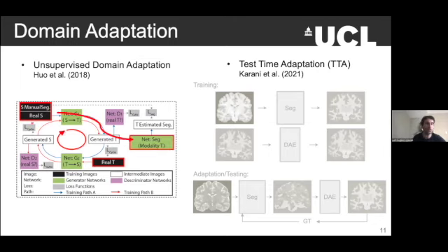It should look like the original T1. And same thing the other way around. And once you've done that, you can take your T1s, make them look like T2s, and train your network. And then you get a network for T2s for free, so to speak. This requires that you have access to scans from the modality in advance. It doesn't always work that well, and it's not very practical, right?